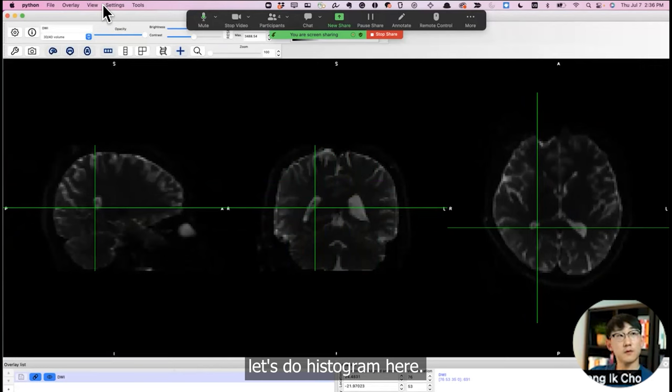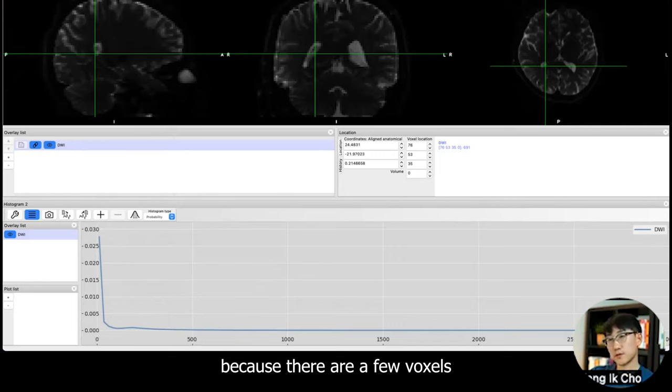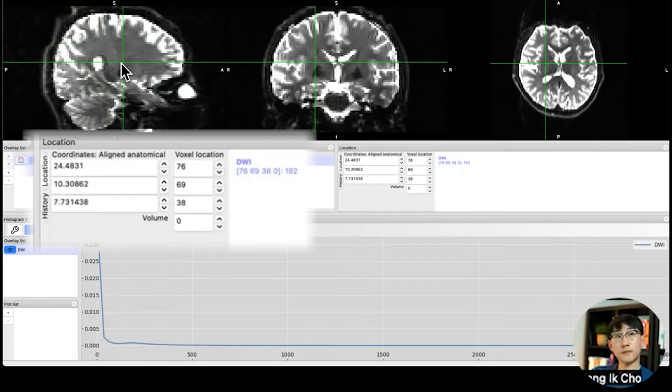Let's do a histogram here. Click on Histogram. Here you can see most of the data, most of the voxels, have intensity less than 500. But as you can see, my maximum is set as 3000 because there are a few voxels with very high value. But most of them lie here. Let me threshold them by 500. So now you can look better at how it looks.